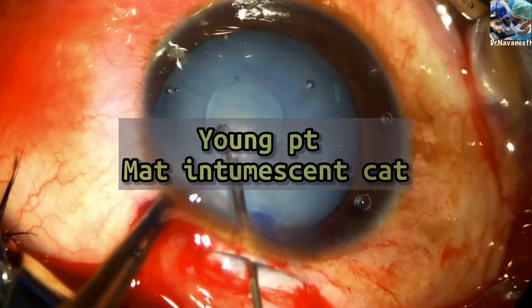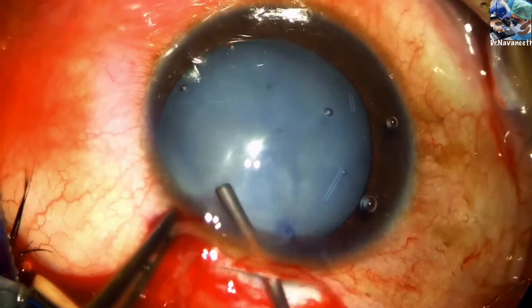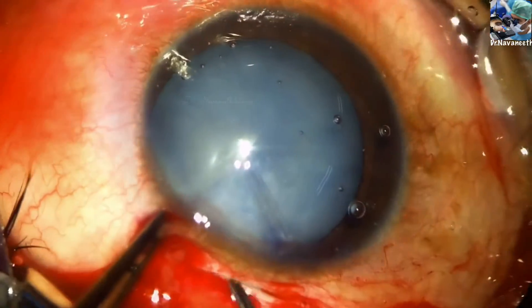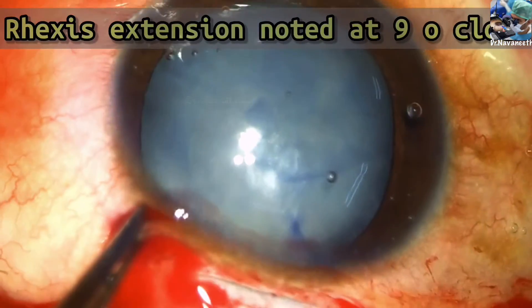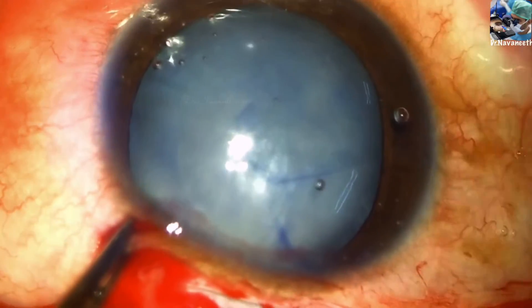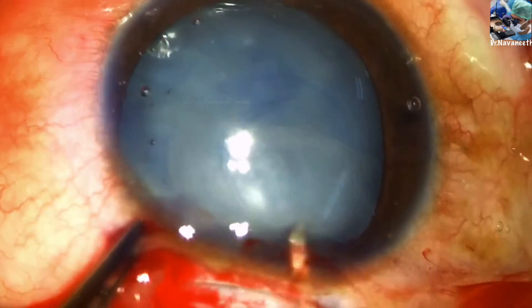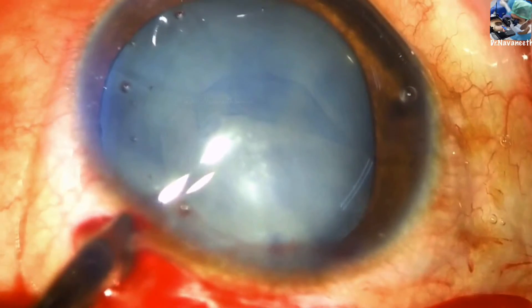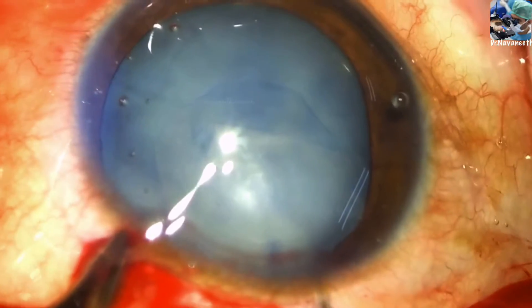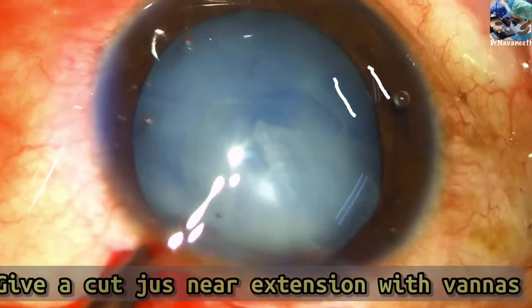This is another case of a young patient with a highly intumescent cataract and highly elastic capsule. Despite complete centripetal forces during rhexis, rhexis extension is noted at nine o'clock.